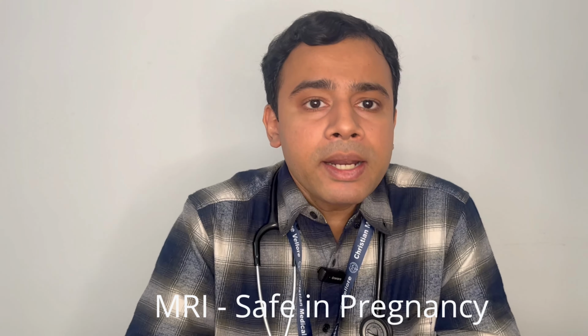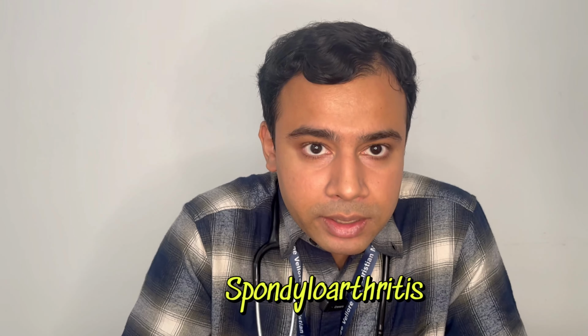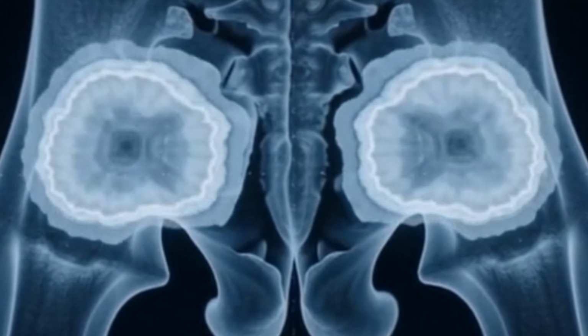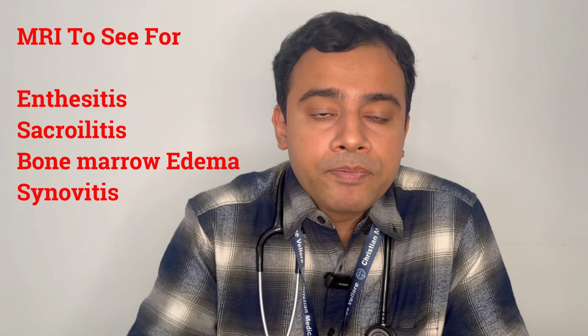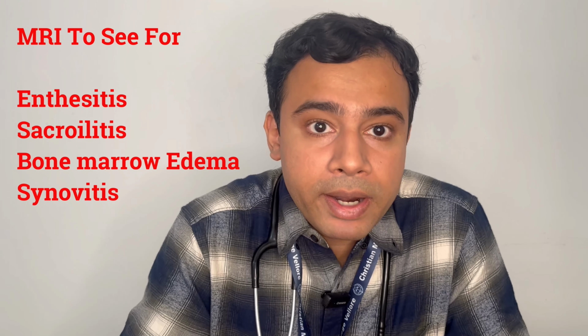Okay, so MRI we usually use in rheumatology for diagnosis of spondyloarthritis. Okay, like your ankylosing spondylitis for example. So here we see bone marrow edema in the sacroiliac joint. Okay, then we can see inflammatory lesions in the spine. Okay, then we can also see enthesitis, we can also see synovitis. Okay, but predominantly we are using it for diagnosis of spondyloarthritis.